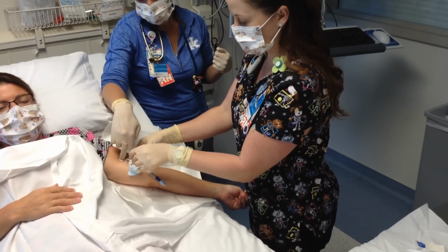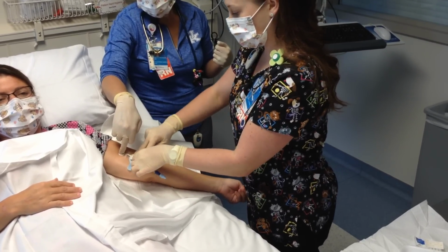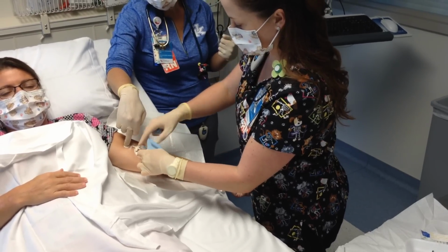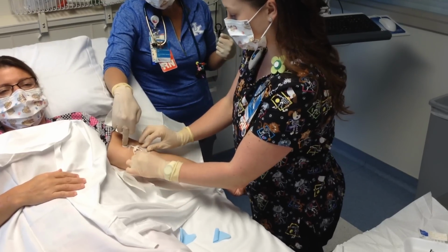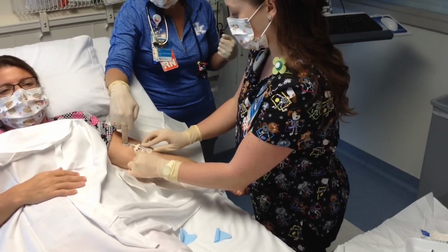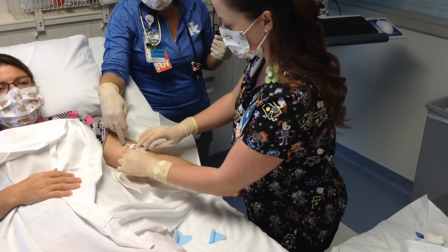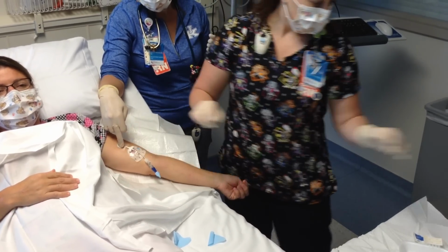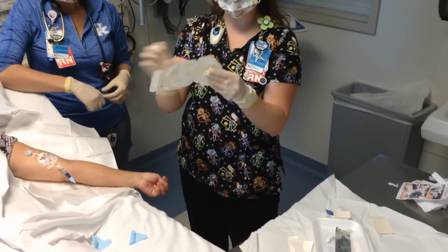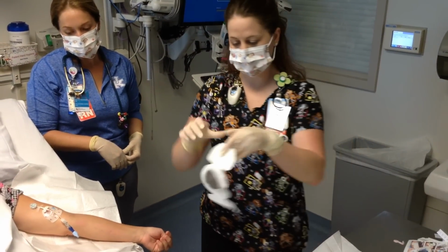The blue pieces, I will hold this here as I pull my blue pieces out on each side. And then be sure to use the warmth of your skin, of your hand, to make sure it sticks well. That's what's most important on a 3M dressing, otherwise you're going to peel. Then we'll put our top piece on. For our 3M, the full back of our dressing comes off.